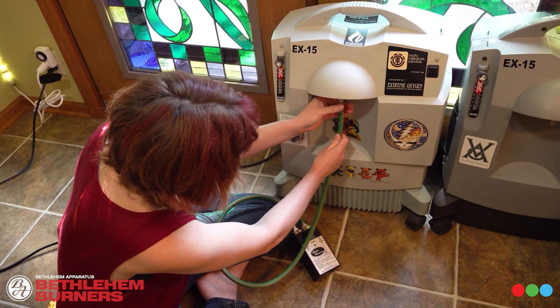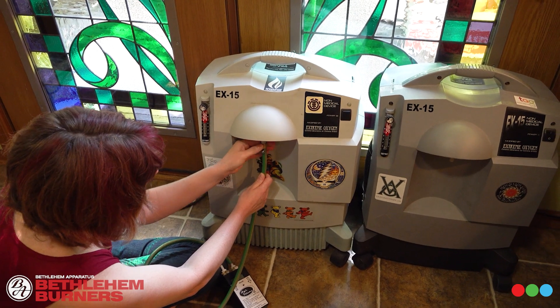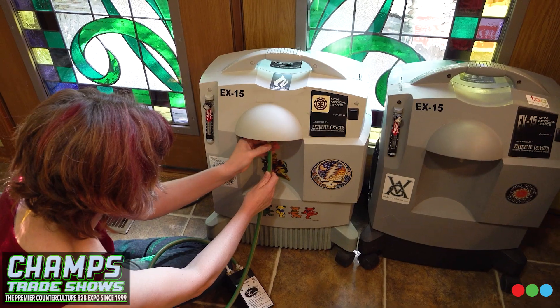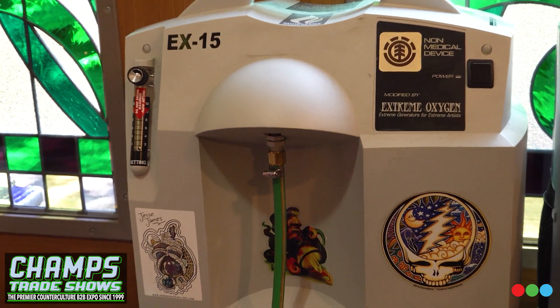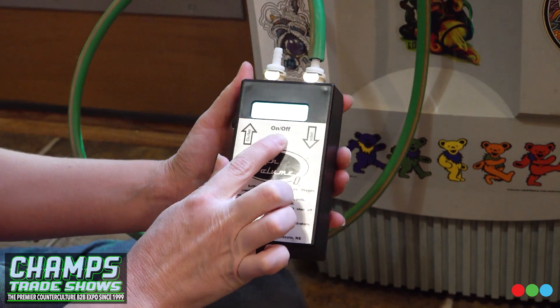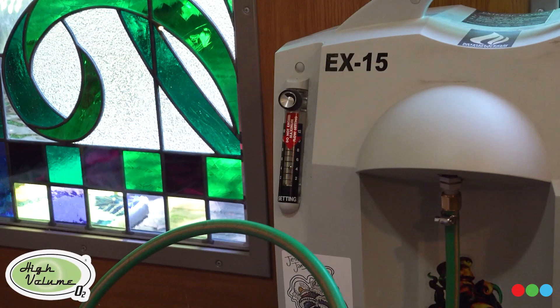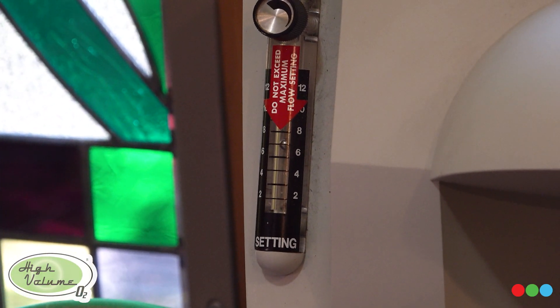I'll show you guys some things you need to keep maintained on these to ensure that you have really good purity, and if you're not getting good purity these are the things you need to check first. Carrie is just screwing this onto the B fitting, and then you hit that button to turn it on. We'll set it to seven LPM.